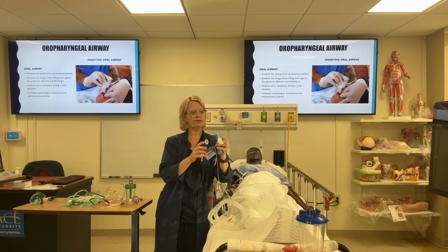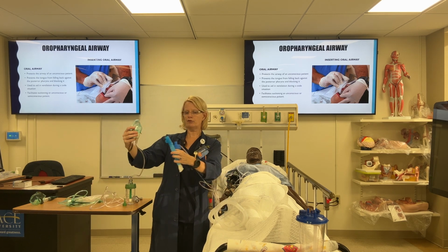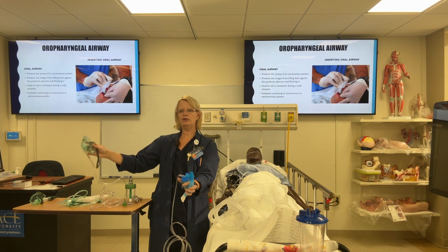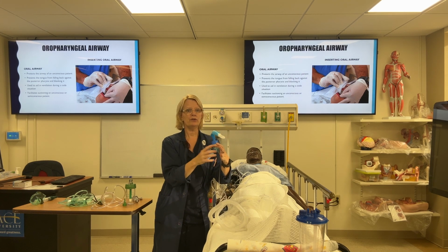If not, I can also take off this piece and pop a simple face mask right onto the device, and the patient can have a face mask if they're unable to hold the actual mouthpiece in their mouth. So I can do either one.